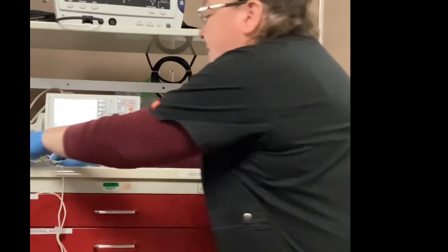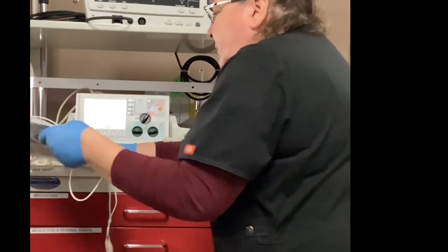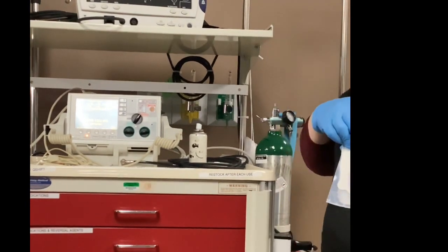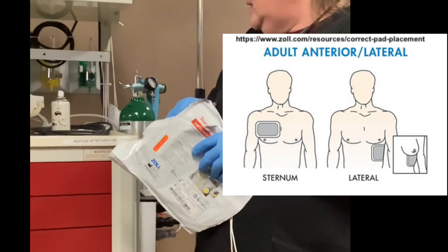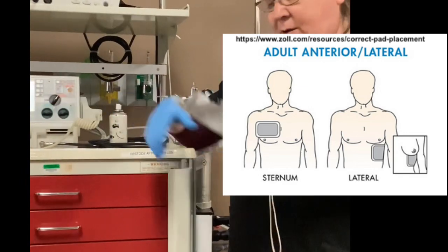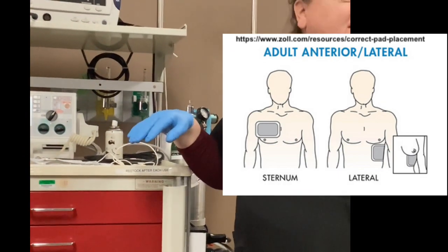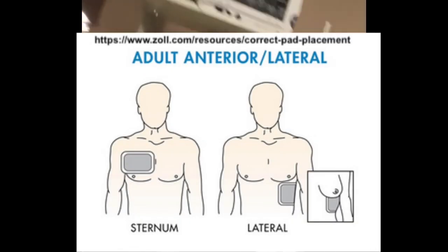So the pads, here are other pads too. These also have pictures on them. You'll see the purple one goes here and one goes here, so you'll hook those up. Now we're going to defibrillate. We go all the way over to defib because this is for a patient without a pulse. So remember, there's nothing to sync to. We don't have a heartbeat that we're going to worry about.